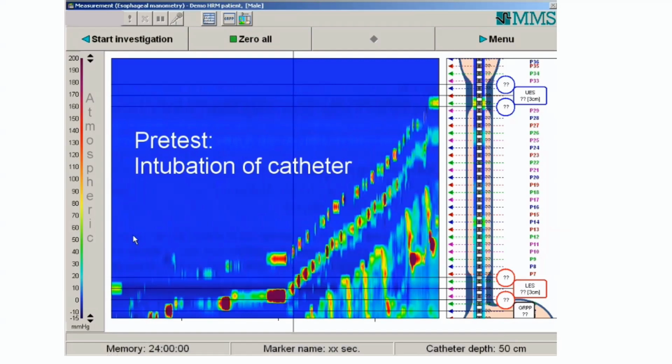If there is a problem in any sensor, you will see that there is a continuous line. It's not changing. That means this sensor is not reading any changes in the pressure. That means this sensor is broken, or maybe it needs more technical calibration.